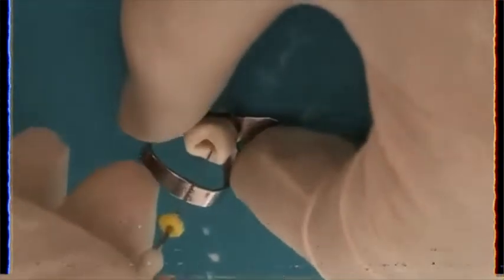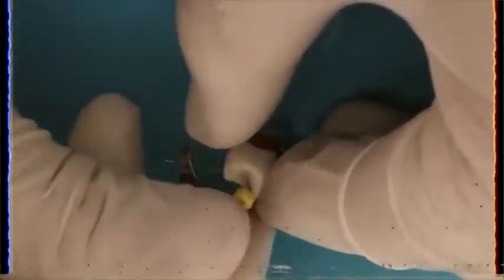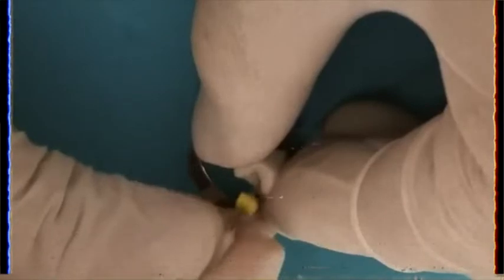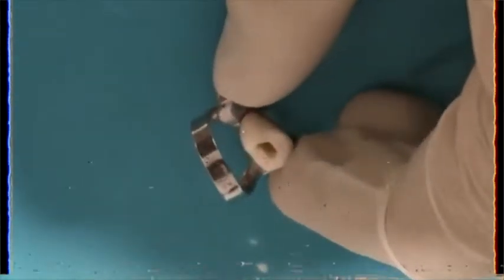Let's proceed now to size 45. As you can see, size 45 is too large and could not achieve the full working length. But you could still file and negotiate for the canal. But it looks like it's not going through. I guess we have to recapitulate.